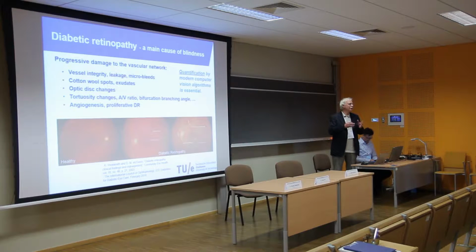And computers can very accurately do quantification. They can count all these microbleeds. They can see the progression of the disease. Is the treatment really working?